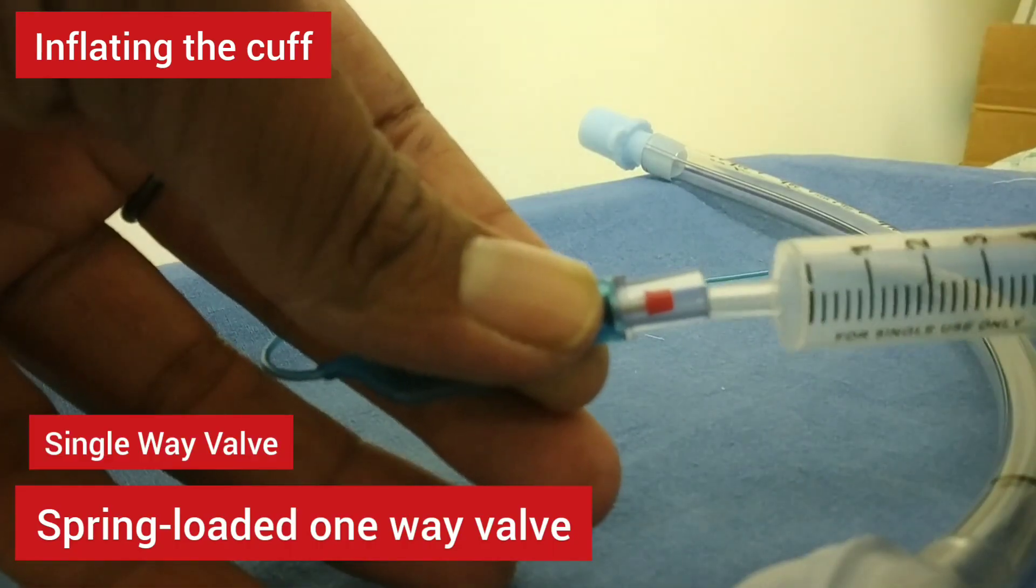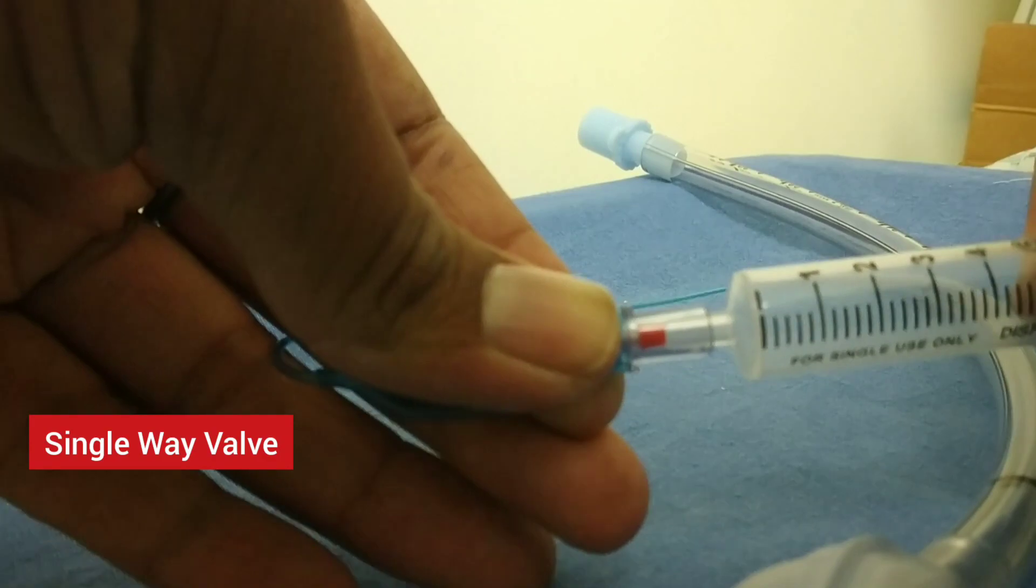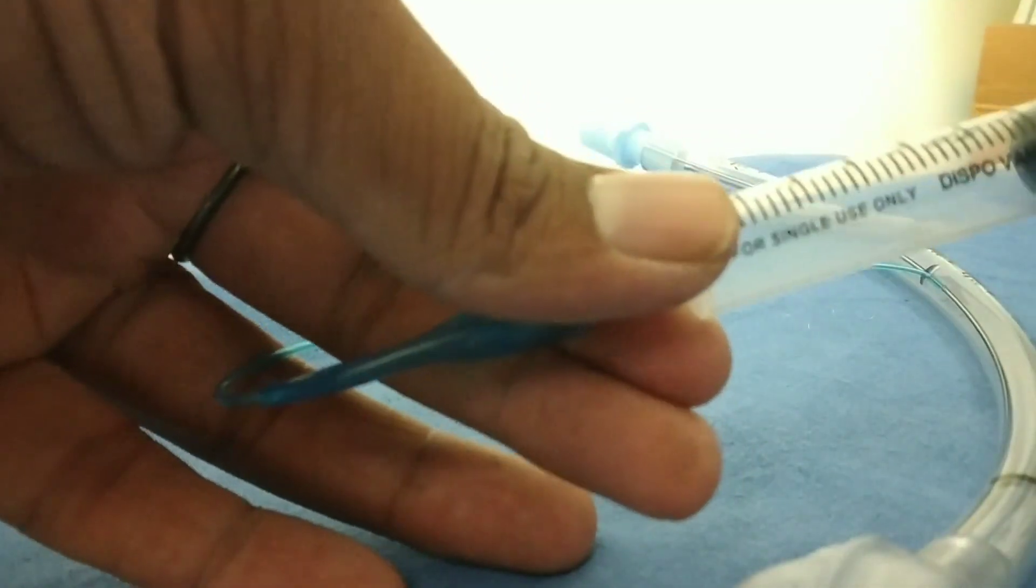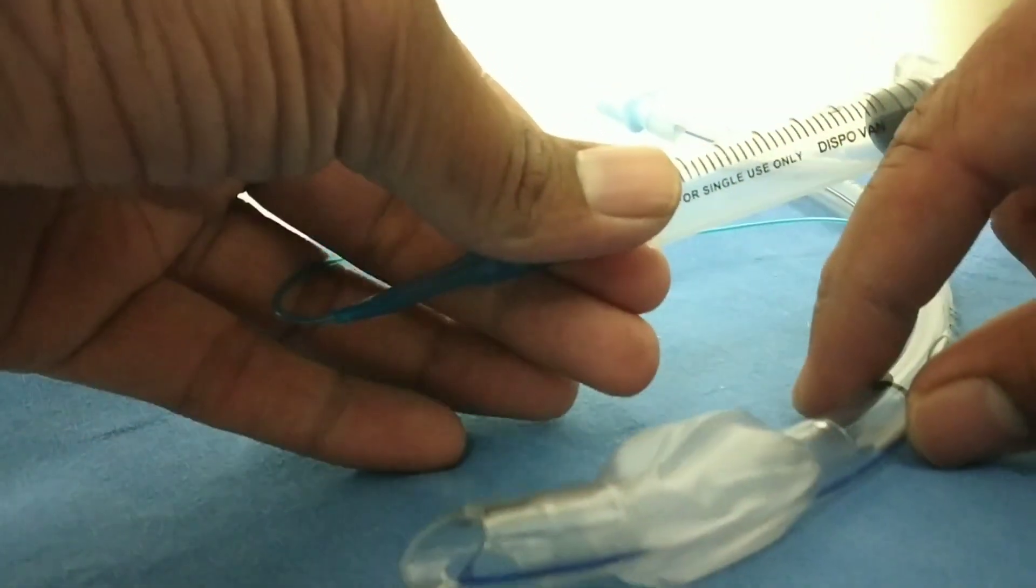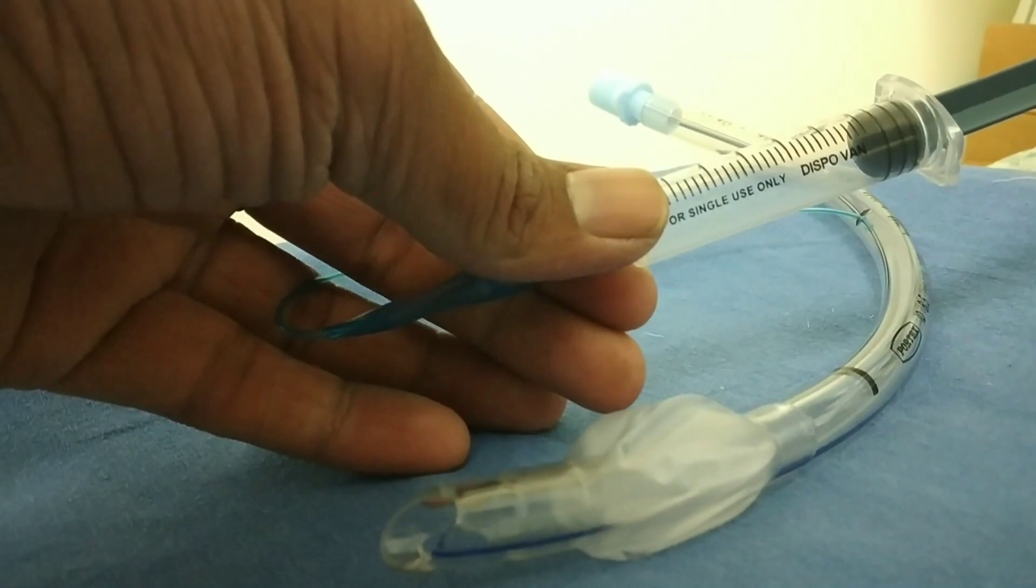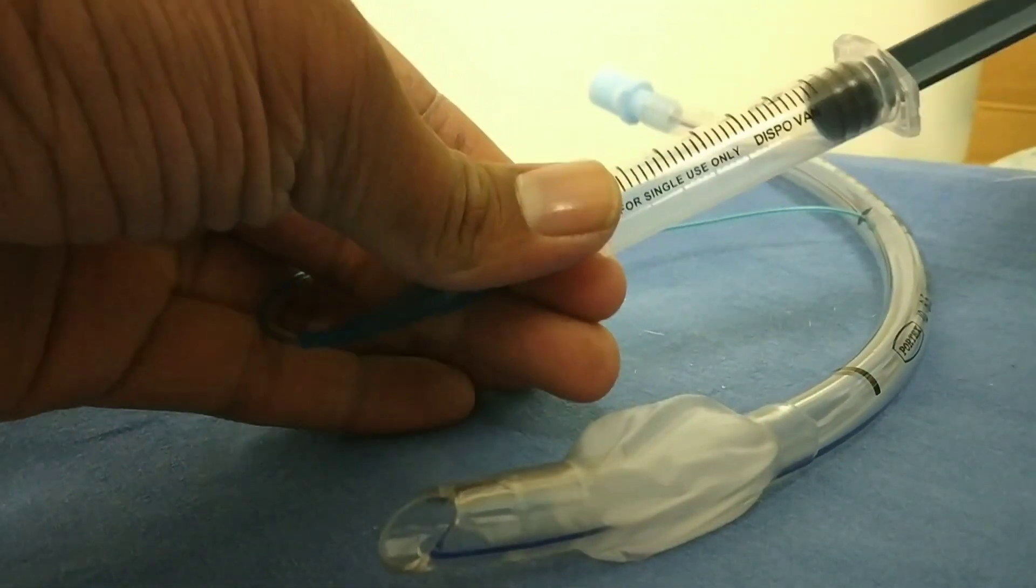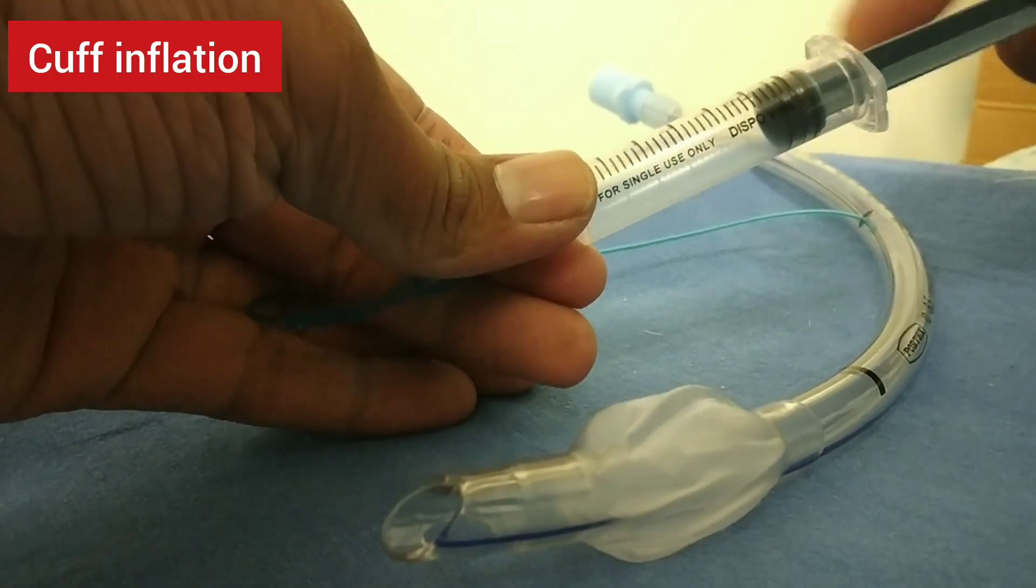After the ET tube is placed, the cuff is inflated. With the syringe, we flush air into the pilot balloon which has a one-way valve. We can see the cuff inflation when the air is flushed into the pilot balloon.